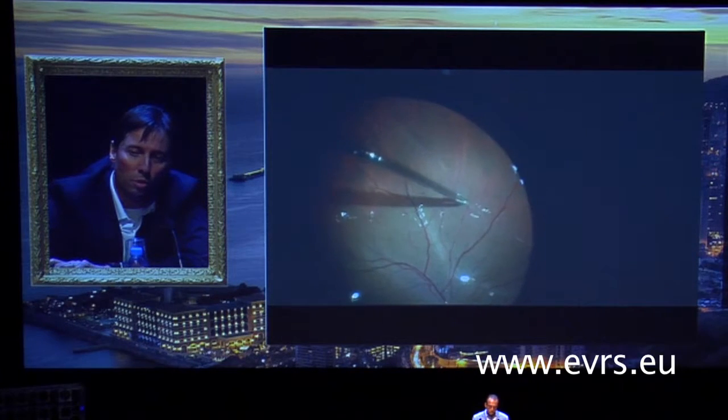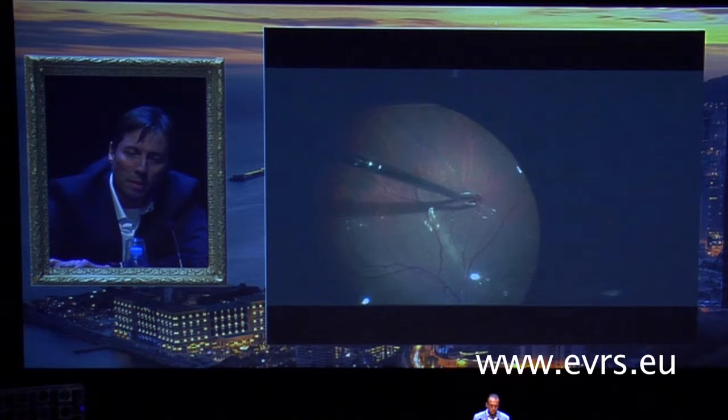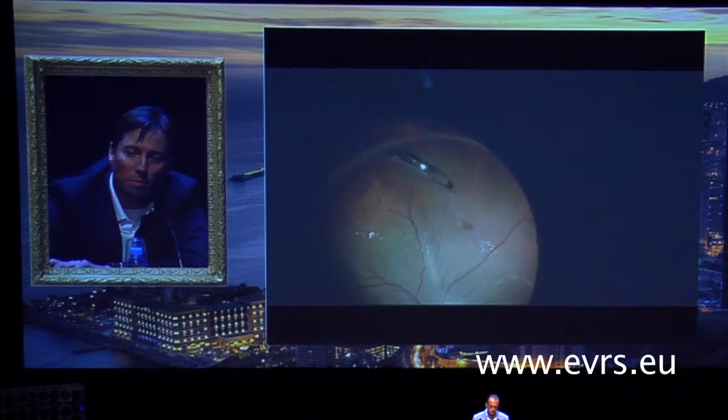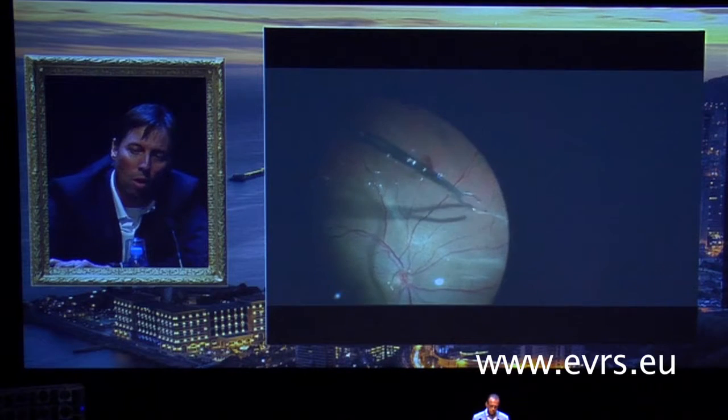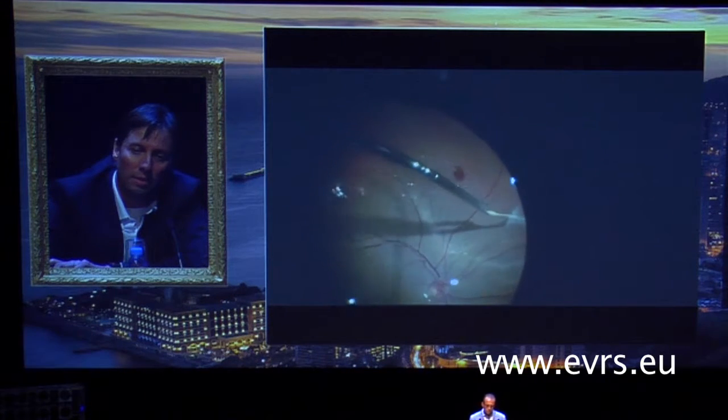Leo? Thank you, Temi. Sometimes we cannot play with subretinal PVR and just leave it alone, but this is a case where we have retinal detachment, and we decided to go in and perform a transretinal subretinal PVR removal. The first thing is fill the eye with a perfluor until the top and just go straight and try to grab directly the strand. You get small hemorrhage, usually in the periphery, different in the posterior pole, and you try to pull it, but you may not get it all at once. So you may leave it like that because you relieve traction, or you can go after and do it in another site.